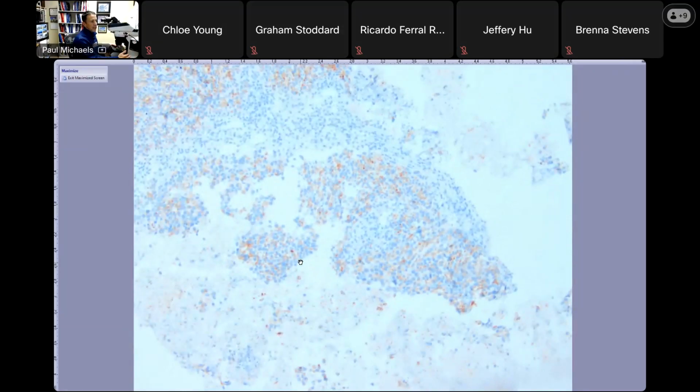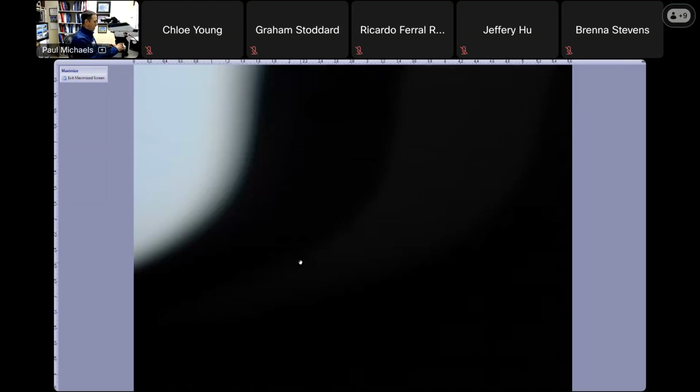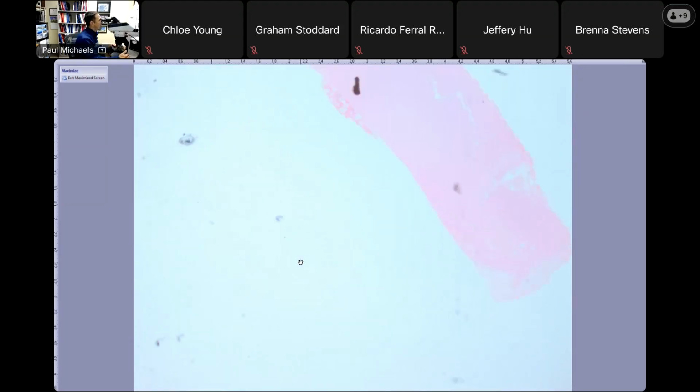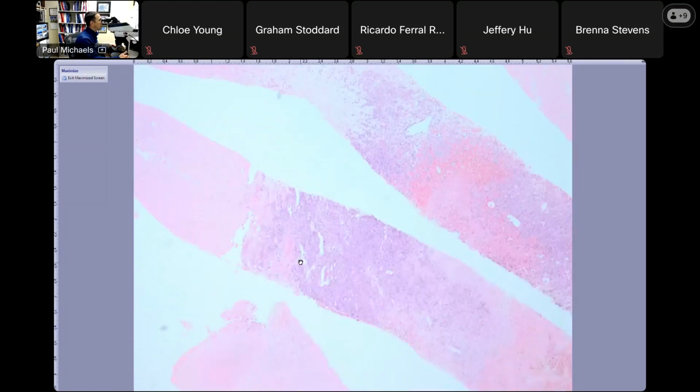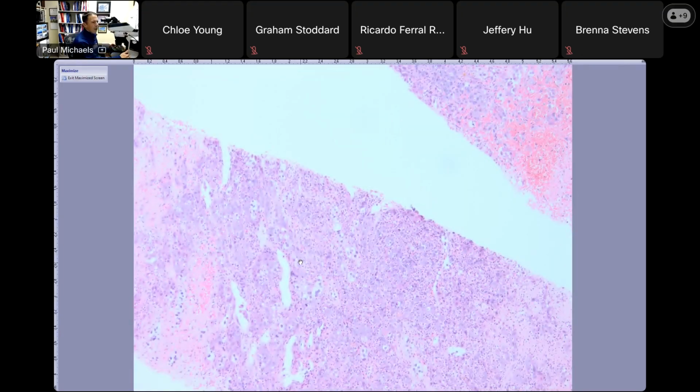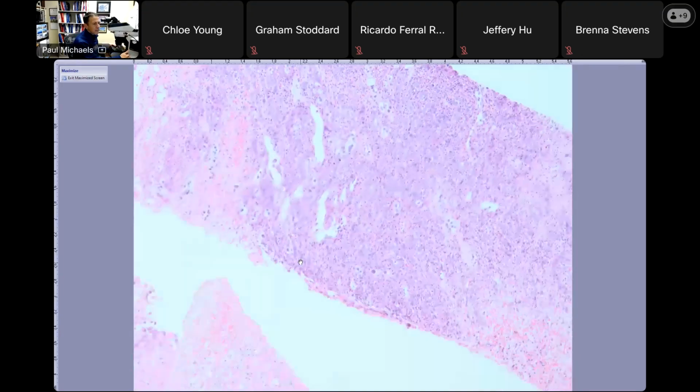So I just wanted to show a lot of these patients usually have a history of malignancy. This one did not, at least of that malignancy. So it was unusual in that sense. But as far as metastasis to the adrenal gland, it wasn't that unusual because, like I said, that's a fairly common tumor. So here's another adrenal core biopsy that I got when I was in Las Vegas.